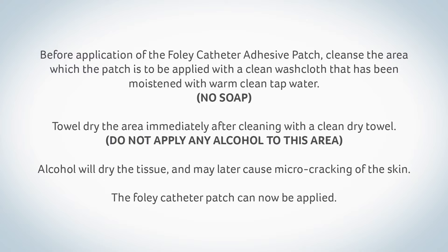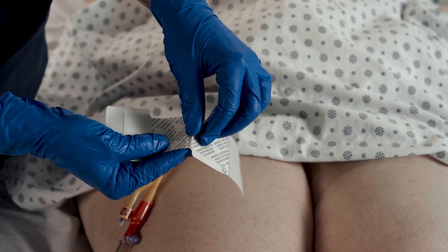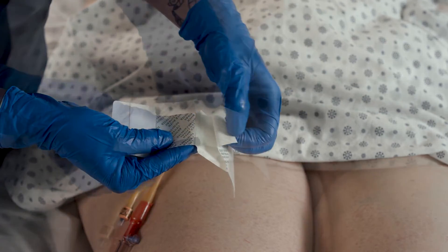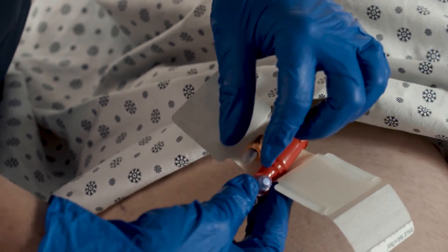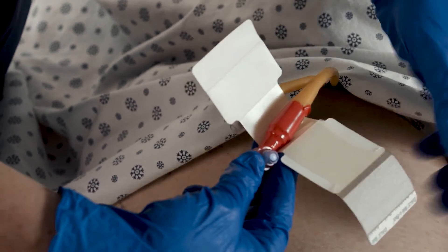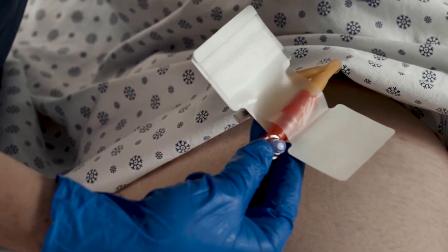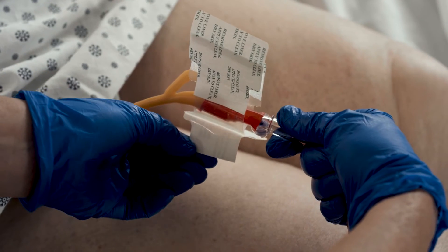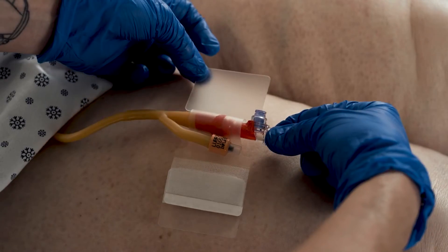The Foley catheter patch can now be applied. Remove both center liners. Place the urinary catheter onto the exposed adhesive center. Carefully secure the catheter on the adhesive area. Fold the tab with liner strip over the urinary catheter to secure it. Remove liners from the product's base to expose adhesive, then apply to skin.